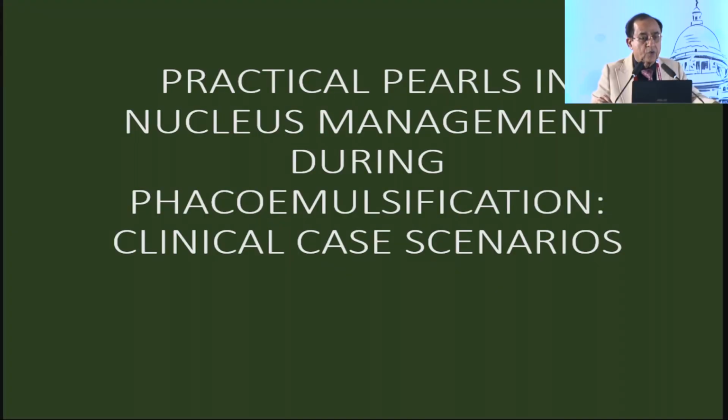So this instruction course is basically on practical pearls in nucleus management during phacoemulsification, and on clinical case scenarios in different situations, and how to handle the nucleus.